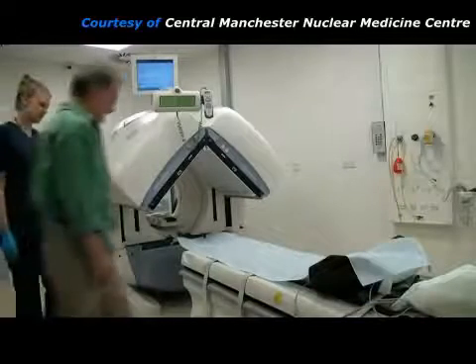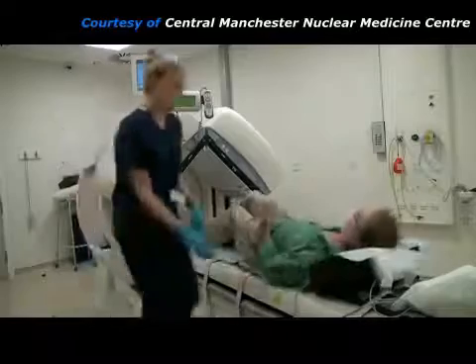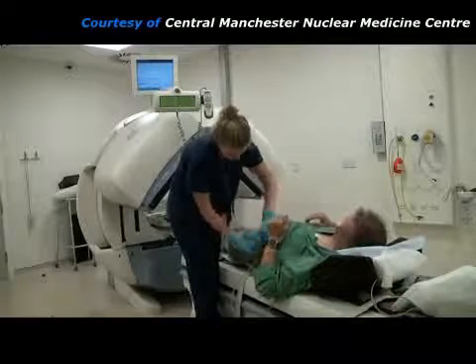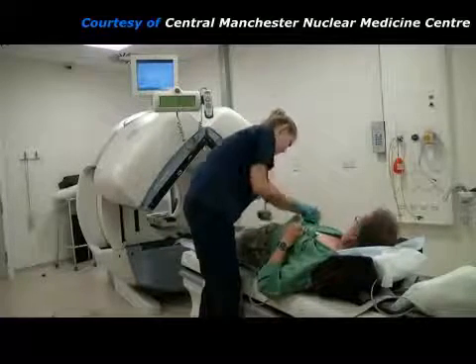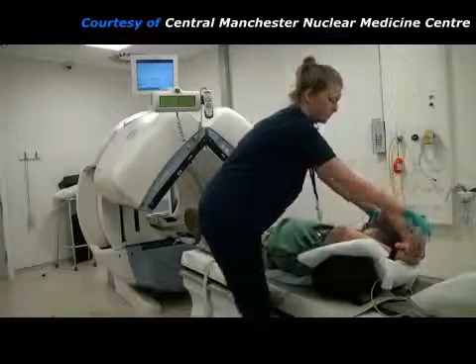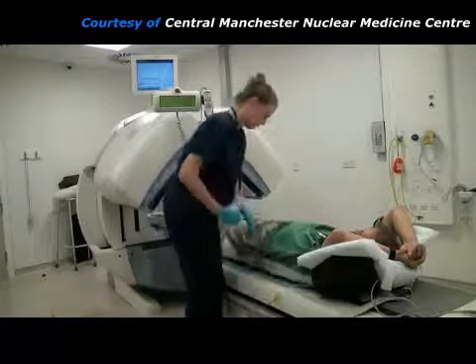This is the gamma camera that will take the pictures of the radiopharmaceutical in the patient's heart. The patient lies on the imaging couch and the practitioner attaches 3 ECG leads to the electrodes already stuck to the patient's chest. This will allow the gamma camera to take pictures at different times during each heartbeat. The patient raises his arms above his head so they will keep out of the way of the gamma camera. Knee supports and Velcro bands help to keep the patient in a comfortable position.